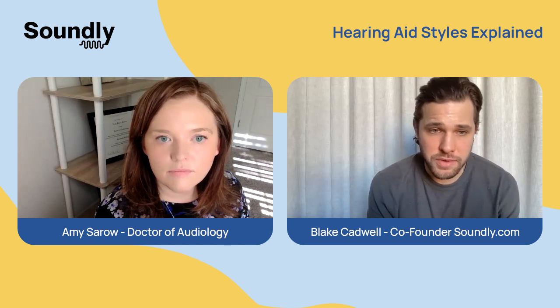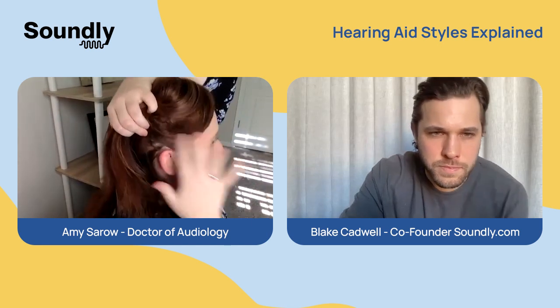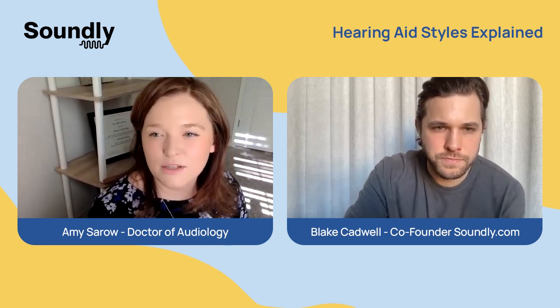Let's talk about category number two, which is in the ear hearing aids. So if you prefer to have a hearing aid that sits inside of your ear, we want you to talk to us about some of the options that exist within that category. Yeah, so here I'm going to show you some different options and I'll explain. So this one is the larger size. It's called an ITE hearing aid. So I'll put that one in so you can see. So this fills up my ear, and that is a custom hearing aid that's going to have the most options in terms of a custom.